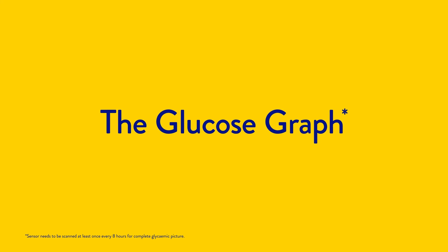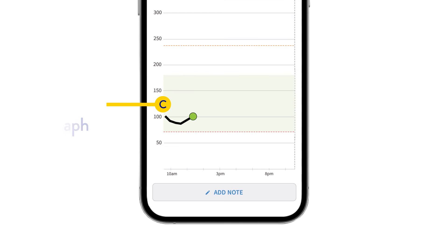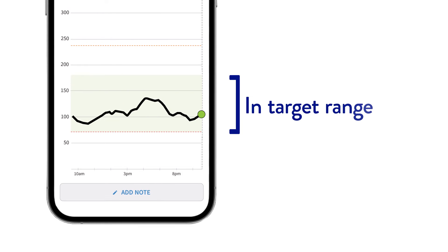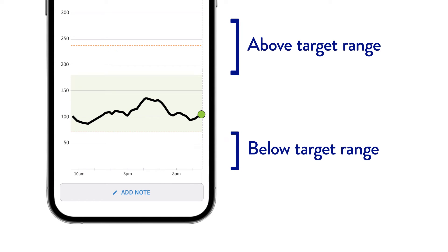Eight hours later, you'll see your first complete glucose graph. It plots your readings and shows you the last eight hours of your readings. It also tells you how much time you were in or out of your target range, helping you understand where your glucose levels have been.